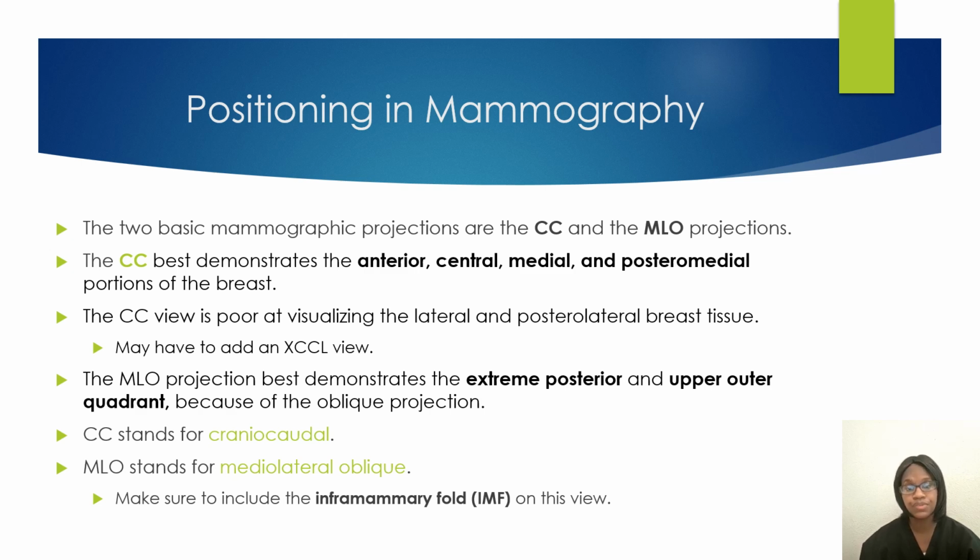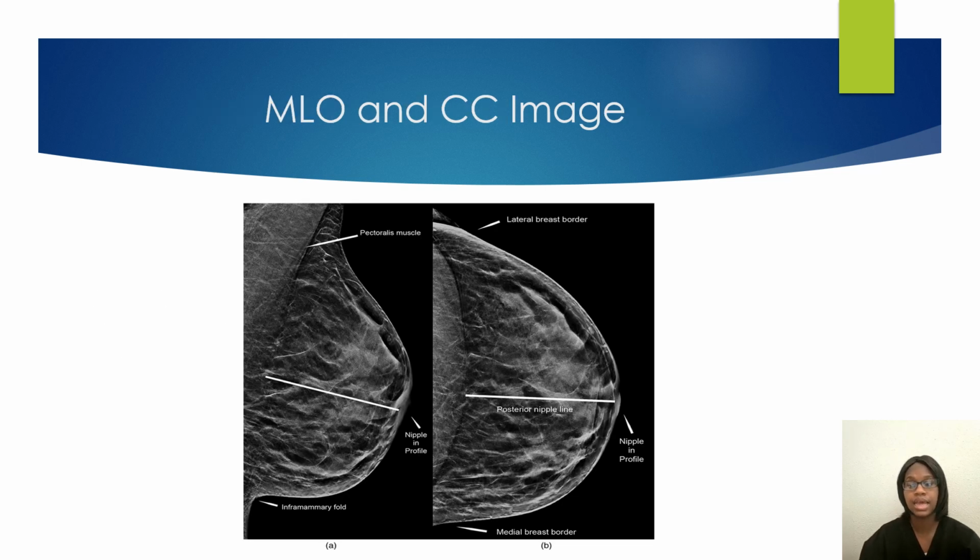Your CC stands for craniocaudal. Your MLO stands for mediolateral oblique. Make sure that you include the IMF on the MLO view. This is an example of your MLO and your CC view. The first picture is your MLO. The picture closer to me is the CC view.